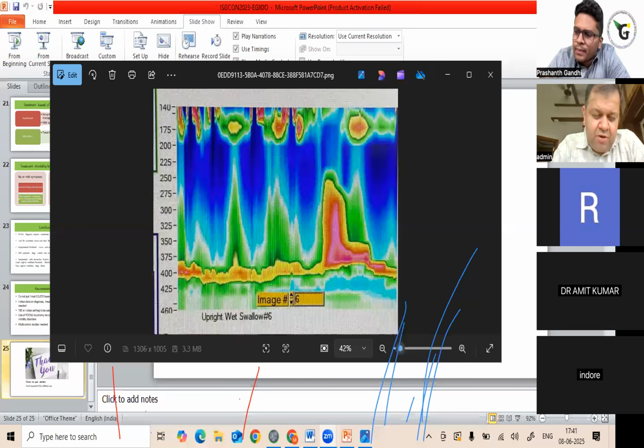So basically, what people have found is either a significant central obesity, a hiatal hernia, or that your catheter has not been placed properly. These are the 3 major reasons that lead to normalization of IRP from supine to upright position. So first, whenever we are doing a study, we should be 100% sure that the catheter has been placed properly.